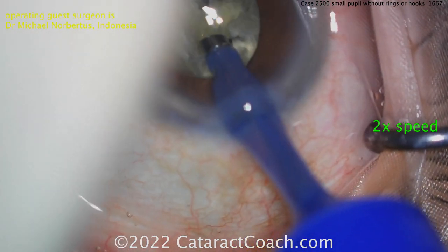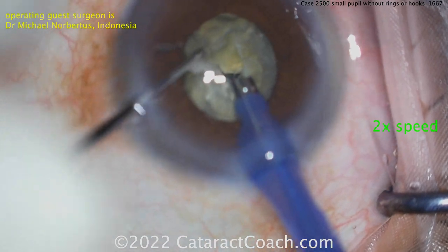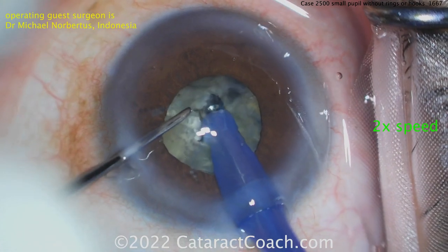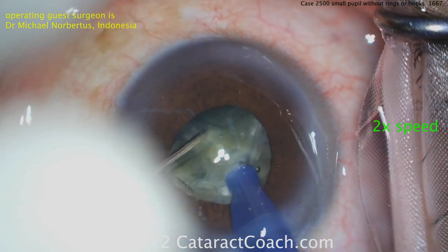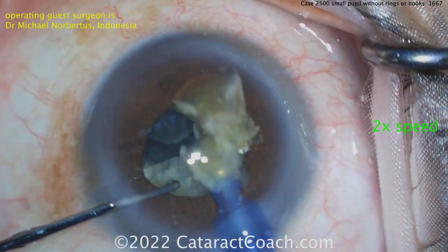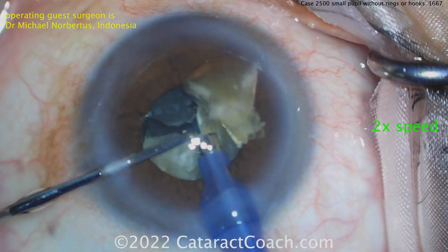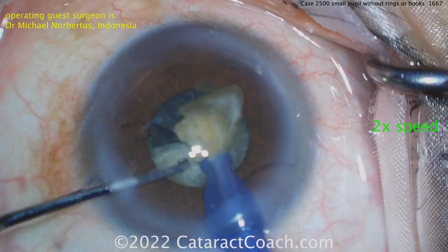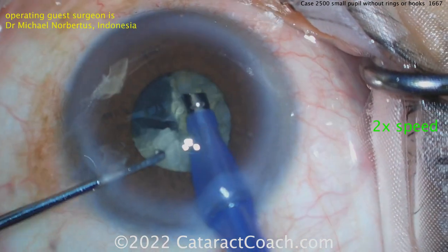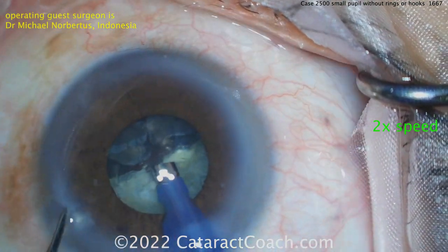A little bit off our screen there and the knuckles in the way a little bit, but that's my advice - you're a beautiful surgeon doing a fantastic job, let's get that camera set. Sometimes it's the patient moving as well. Now taking out these pieces, more chopping - really beautiful technique. All the pieces are small, less than a quarter, and these can all be brought up in the iris plane and emulsified pretty easily. This is a phaco chop, a horizontal chop, done through a small pupil.